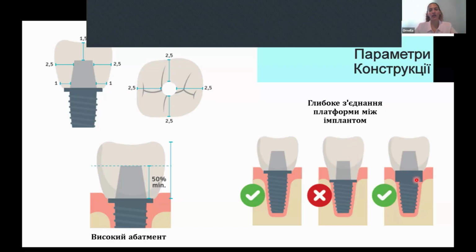So the solution to solve this type of situation is to choose a T-base or an abutment with the correct height of the gingiva, so we can level up the connection a little bit and then choose the correct surface for cementation. This is going to help us to have a correct planning of our prosthetic.